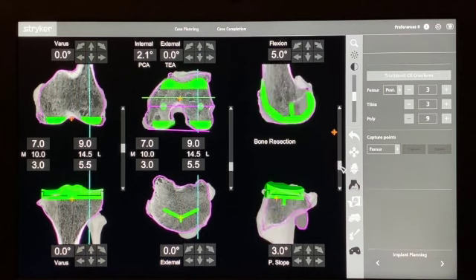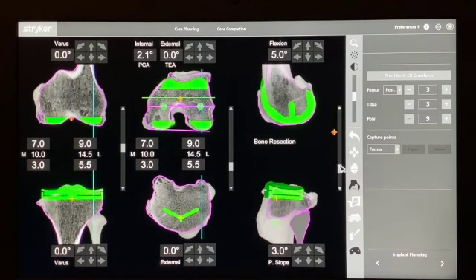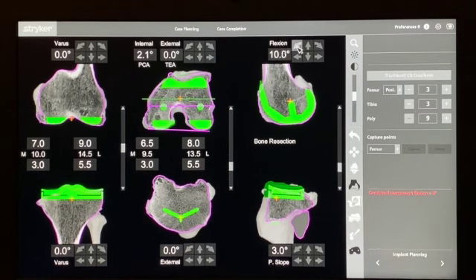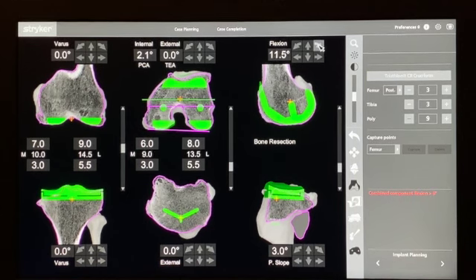and if you're going to adjust the femoral rotation, it's worthwhile lining up this little red arrow with a peg on the femoral component. And that allows you to rotate the femoral component while keeping the same distal and posterior margins to your prostheses. And you can see as we flex this component, the trochlea actually gets closer to the native trochlea. Right, and as we extend it, this takes the trochlea a little bit further away from the native bony trochlea. All right, so somewhere along here there is a sweet spot.